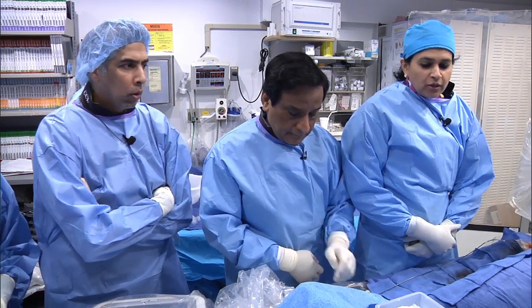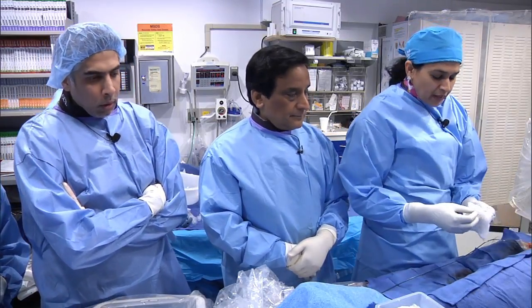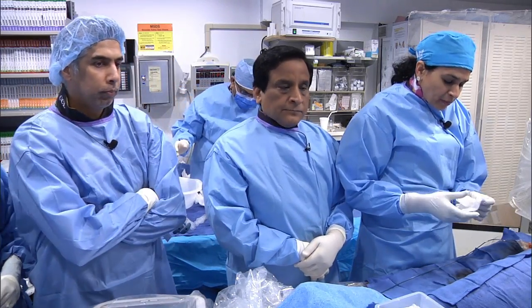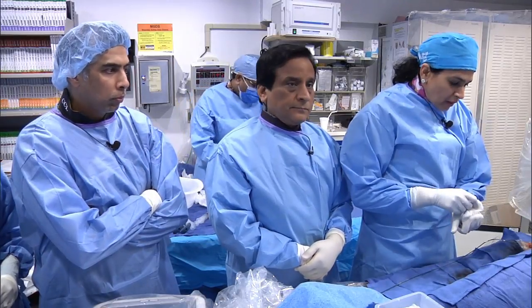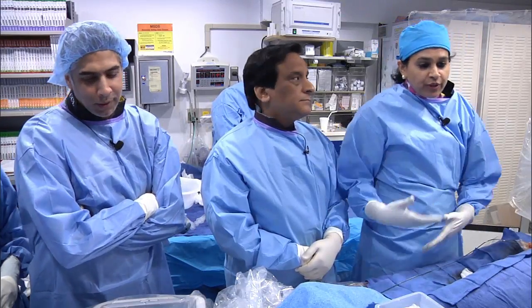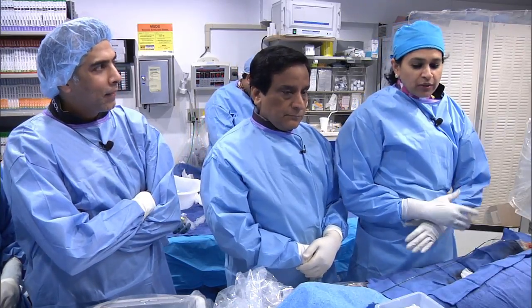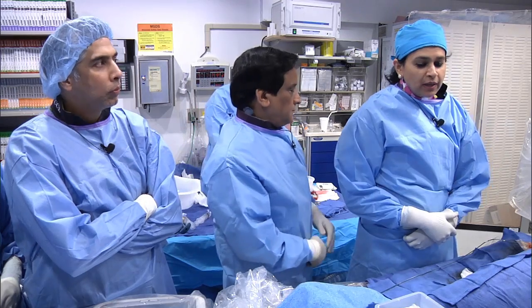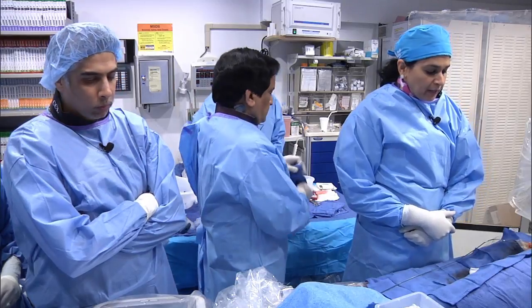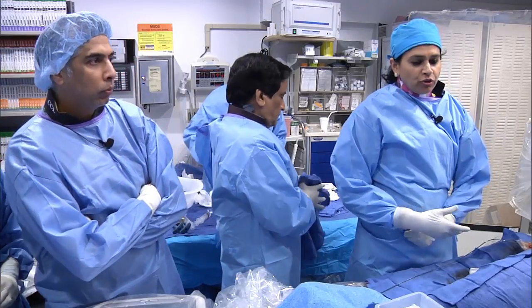I think if we go back to our live cases, I don't know if Dr. Mehta remembers, every time people ask me to comment on radial, of course, radial is very good for two reasons: decreased bleeding. All you need is one femoral hematoma or pseudoaneurysm, and the patient will not like you for the rest of their life. Since they can see it, they will not know what was done inside, and they cannot figure out how complex a procedure you have done. But what they see is what they believe, that you did a bad procedure, compared to the radial, which is good, with decreased vascular access complications. That is one good thing about radial, and of course patient comfort.